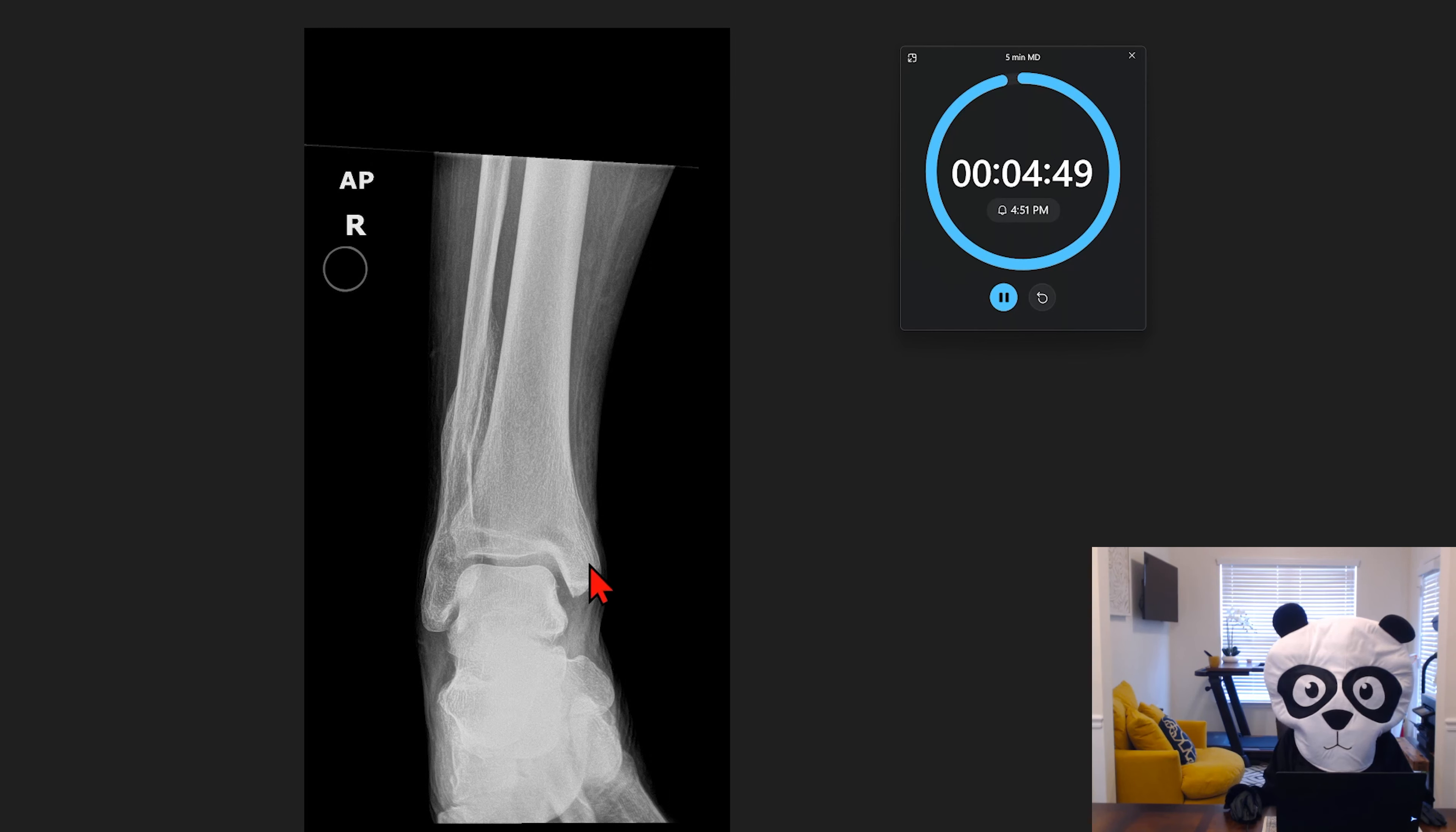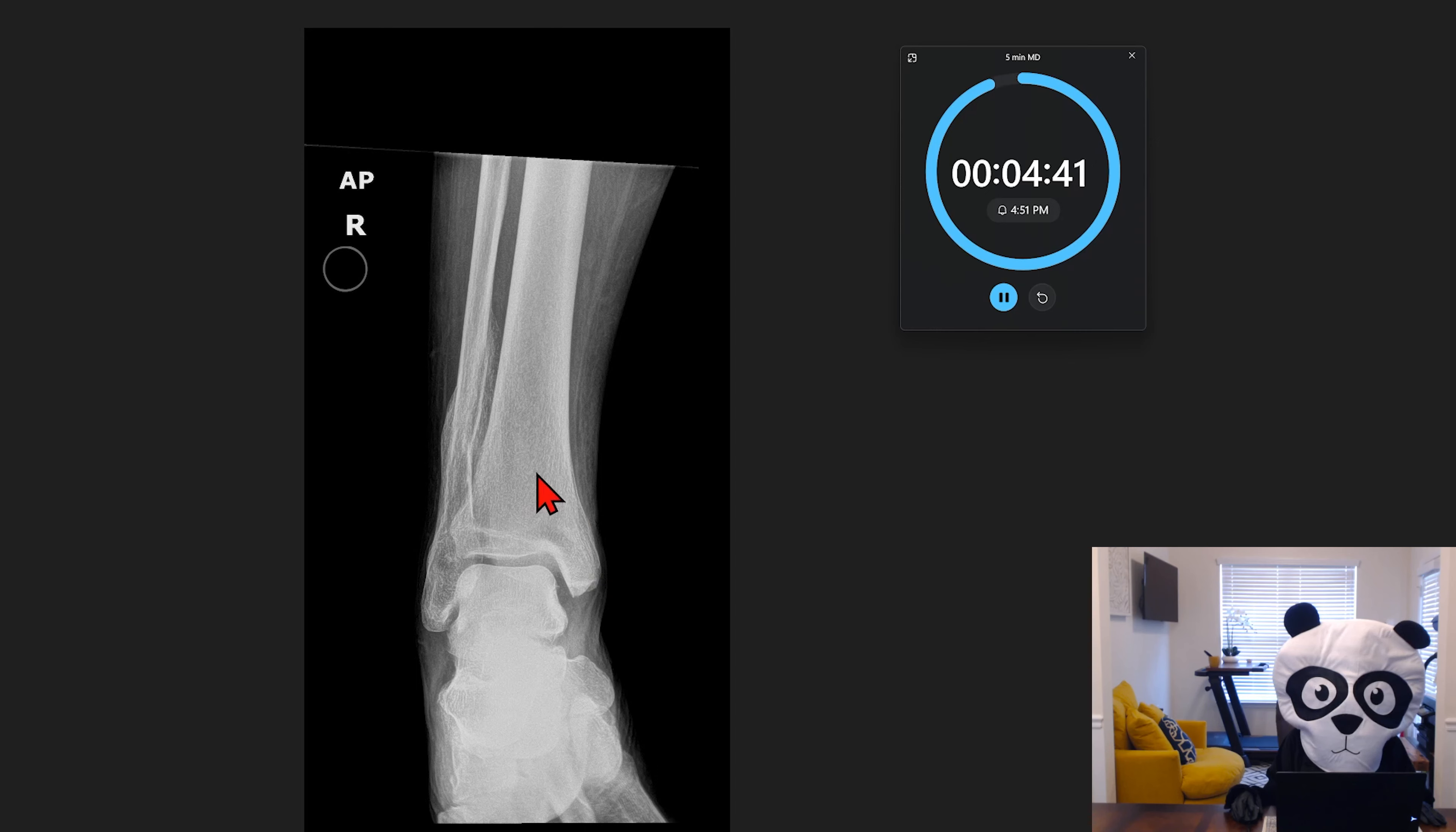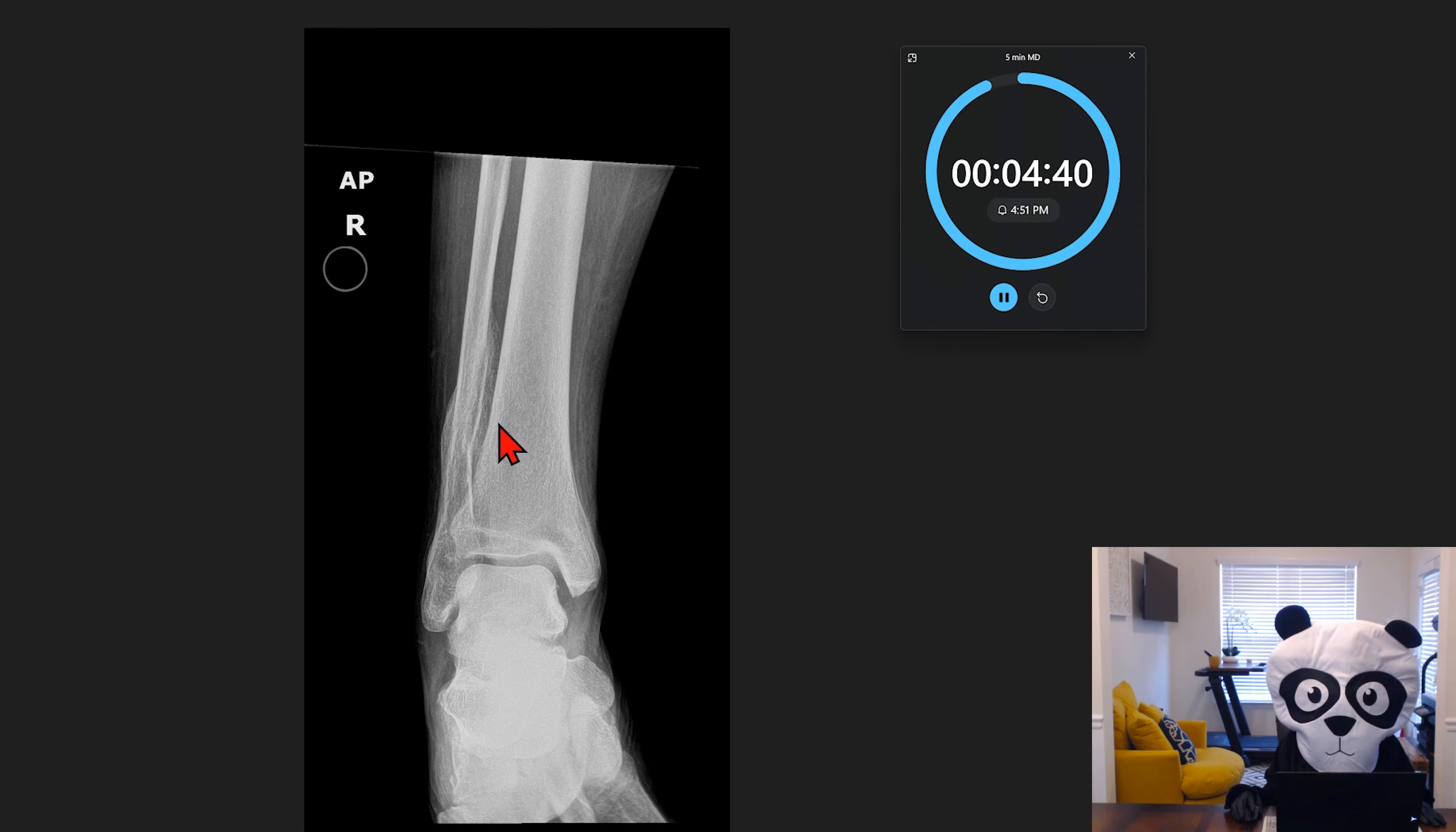So right off the bat, just taking a generalized look at the anatomy, we have the distal tibia with the diaphysis and the metaphysis. We also have the distal fibula as well.